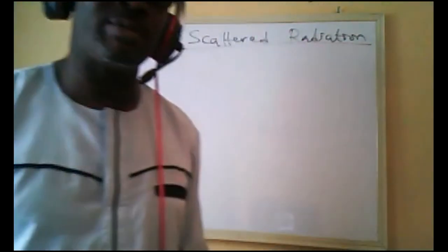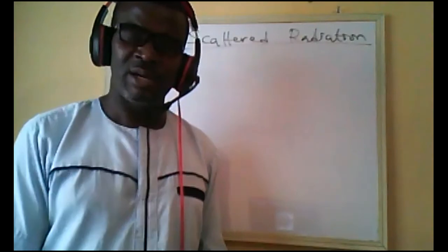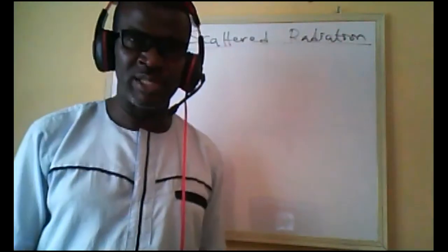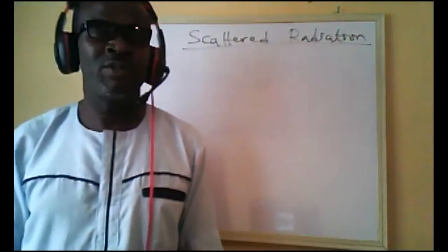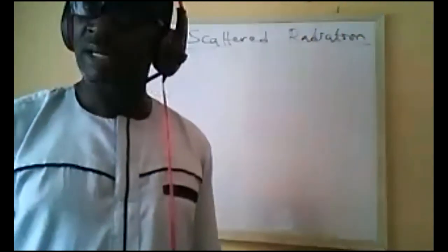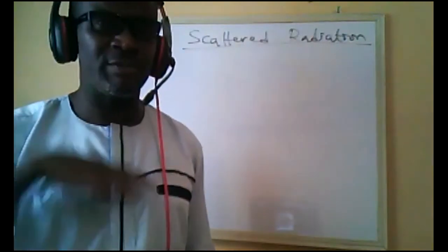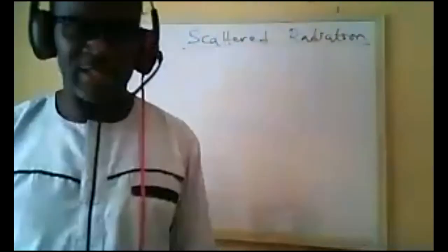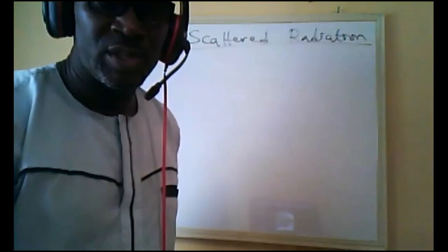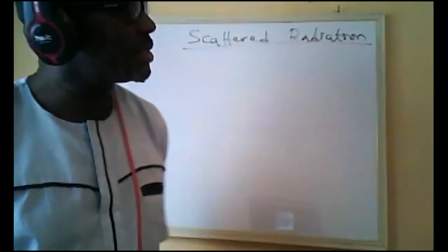That is why it is advised to have the tube underneath, with the image intensifier or the flat panel above, so that the lead drape will cover the operator. But if you have the tube up, the scatter radiation from the patient will hit every part of the radiologist, the fluoroscopist, the neurosurgeon, or the orthopedic surgeon, from head down to eyes, even though he or she wears PPE, personal protective equipment. So we want to reduce that scatter radiation as much as possible.